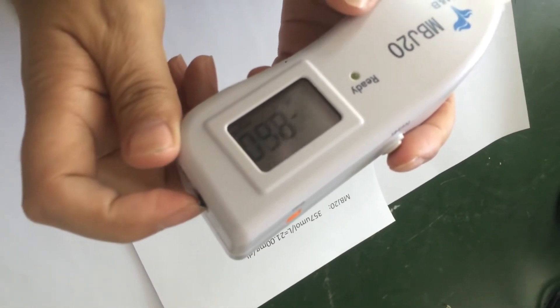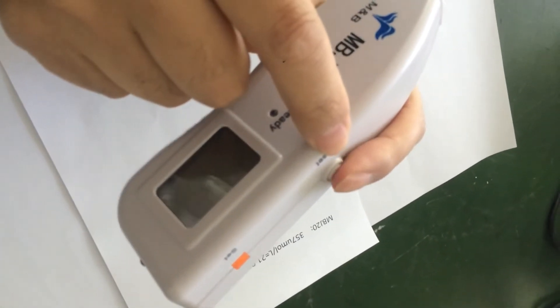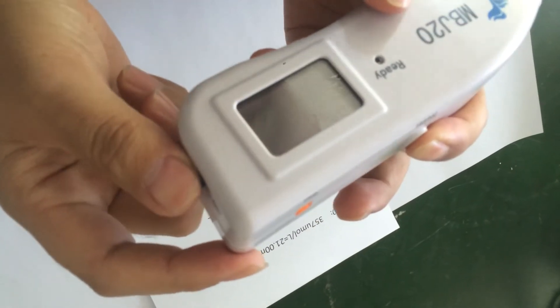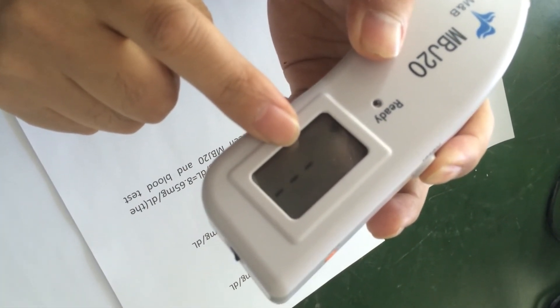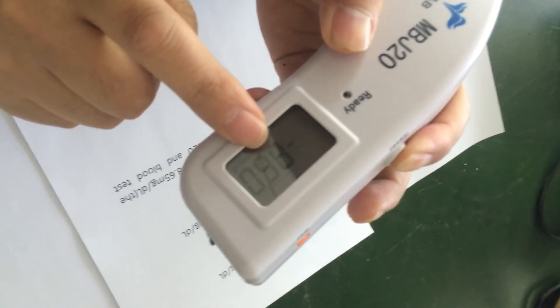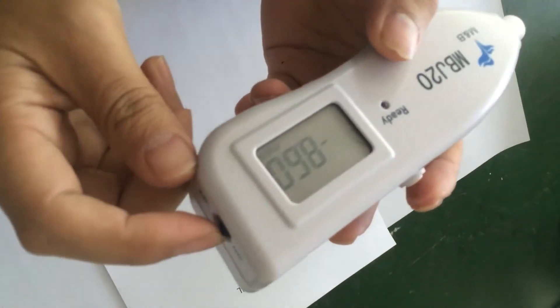Okay, let's check it. Turn it off, press this button, and at the same time switch on, and wait until the number appears. Okay, we can get the number — that's right, this is the correct number. We can confirm the reduction is done. Okay, no problem.